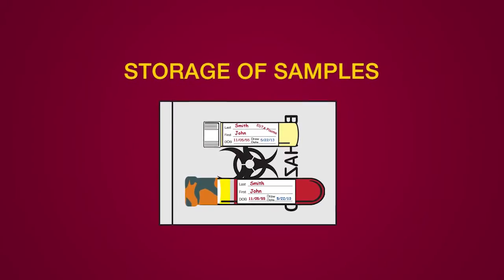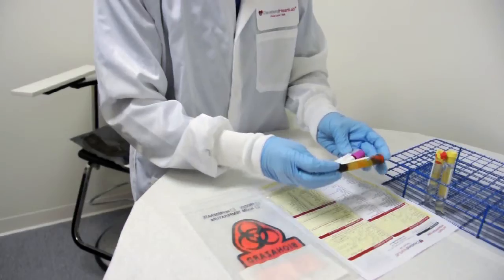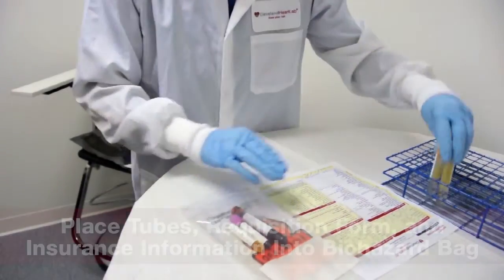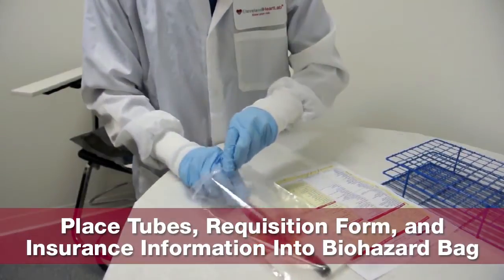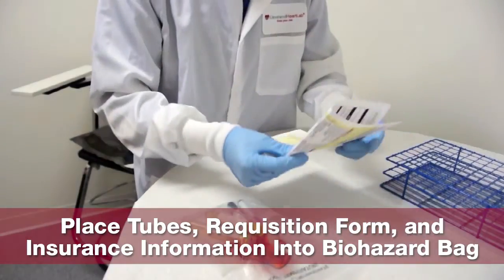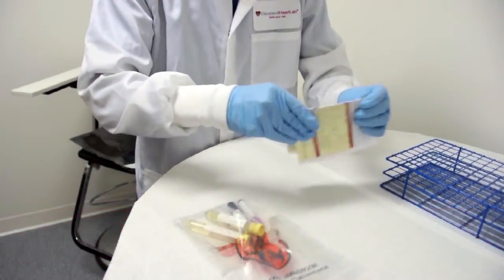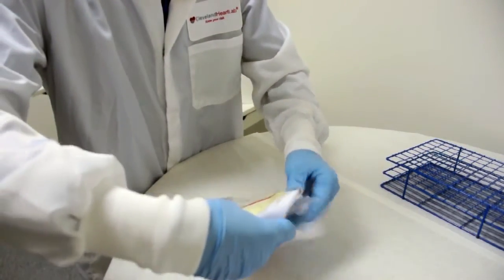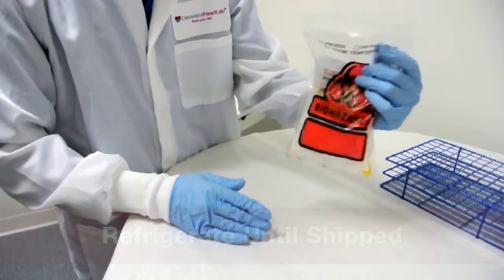Storage of samples. Once you have collected all the tubes necessary for desired testing, place all labeled tubes in a biohazard bag and place the corresponding requisition form with a copy of the patient's insurance information in the front pocket of the biohazard bag. There should only be 1 patient per biohazard bag. Keep all the samples in a refrigerator until they are ready to be shipped to Cleveland HeartLab.